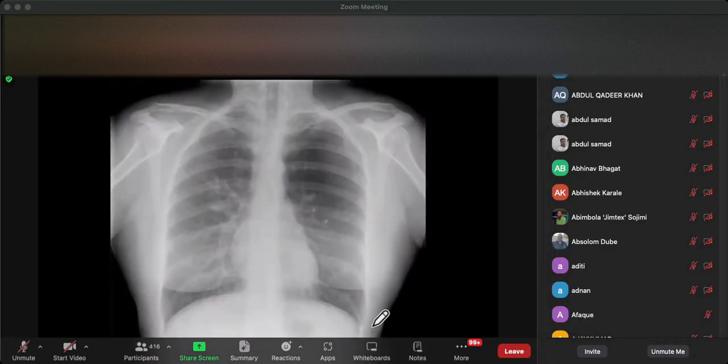Okay, this patient has got a hypertransradiant left lung, just here, okay? So hypertransradiant left lung, there's a paucity of blood vessels on the left compared to the right. Therefore, it must be a lung problem, not a chest wall problem.